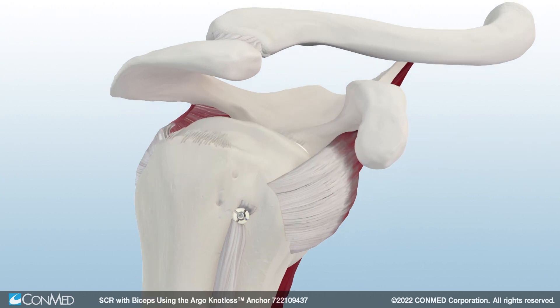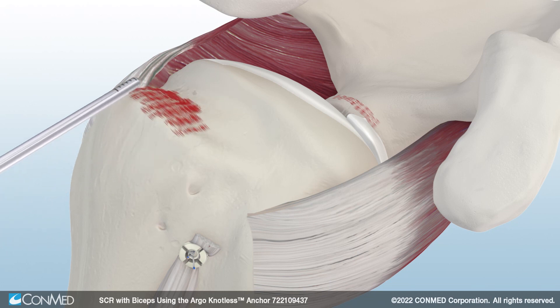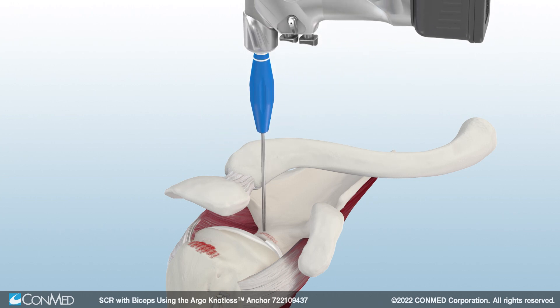Then, prepare the superior glenoid and greater tuberosity using the ConMed Stealth Shaver Blade. Use a spinal needle to identify the desired glenoid anchor positioning. Insert the Y-Knot Flex Drill Guide and prepare a pilot hole for the 1.8mm double-loaded anchor.